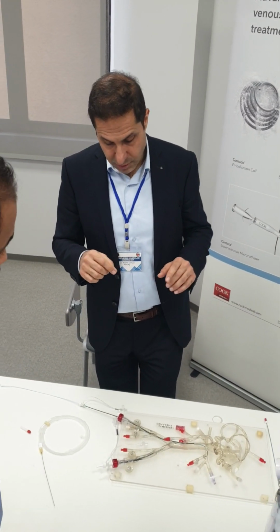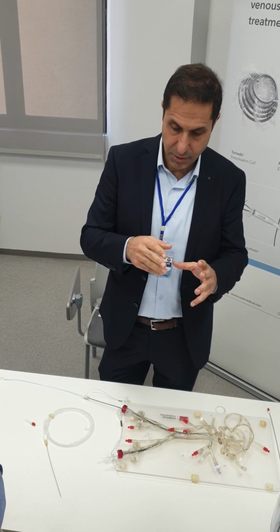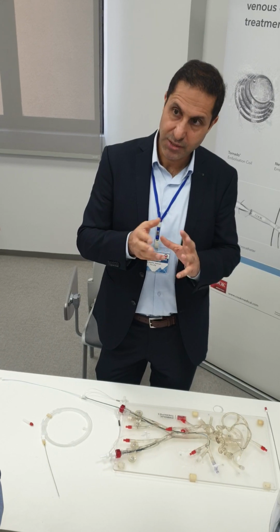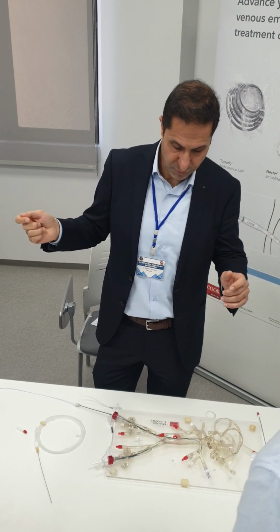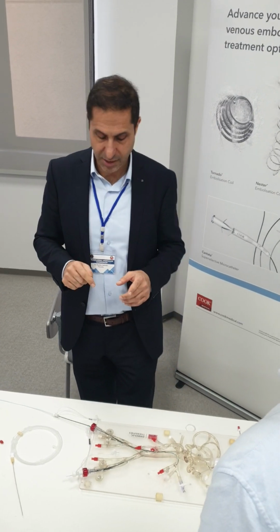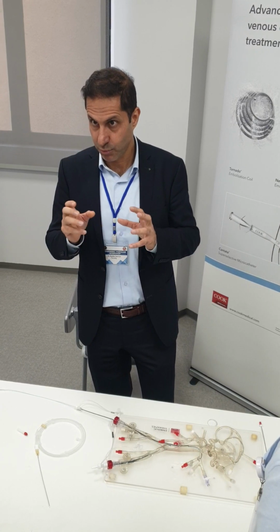The retractable coils, you can push it inside an aneurysm or a vessel to occlude it, but if you are not happy with the position, you can pull it back and readjust and even remove and attempt another position of the catheter. The shape of the coil is also important.